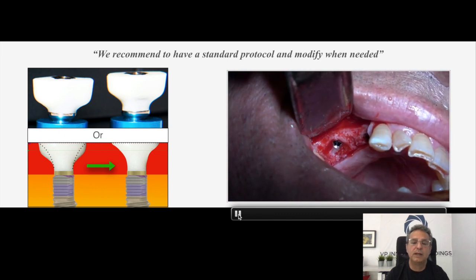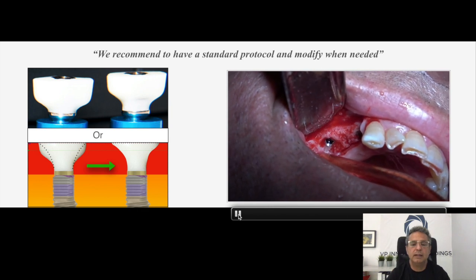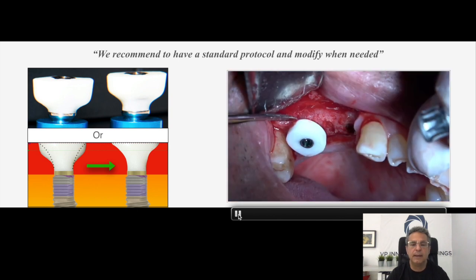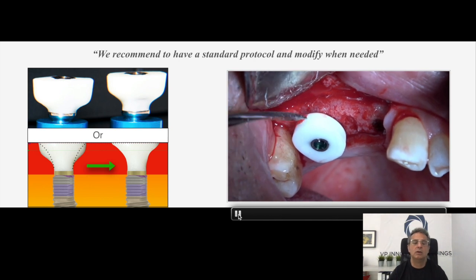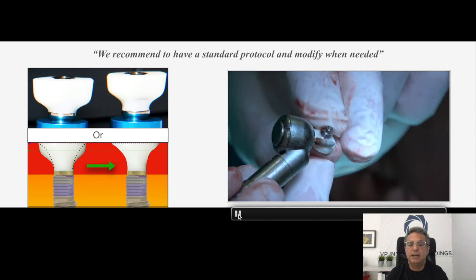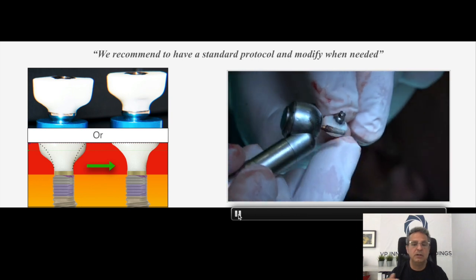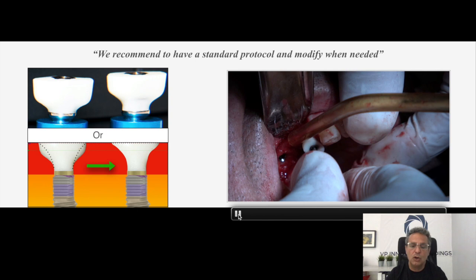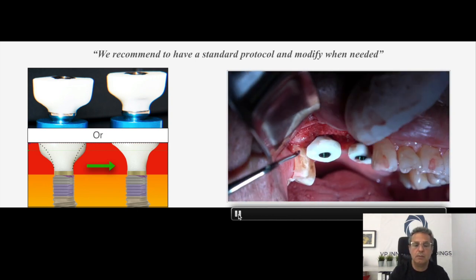He will now put on the custom healing abutment. And he can determine now, do I need to relieve some of the composite? Because, yep, it's too tight. There's no room for biology to do its work. So immediately he can remove and reduce and give the shape that he needs. The mouth is unpredictable. So you need to be versatile. You need to be able to play with these things. And composite allows you to do that. As long as you polish it properly, you're never going to have an issue. So I'll move along.